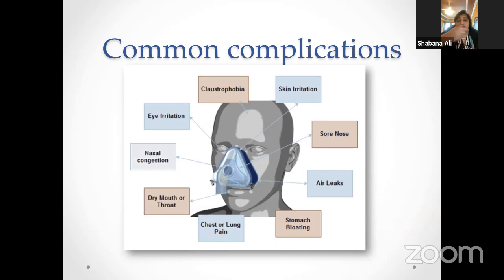Sore nose, because the air is going through the nose with great pressure, and as we said, this may dry up the mucosal layer of the nose, and then the nose becomes sore. Dry air leaks, a very, very common problem. The air is leaking out of the mouth if the mask is not tightly fit, and if you fit it tightly, they get skin irritation. So it's really a challenging situation for an ICU nurse to keep the patient with the mask on and the air not leaking out.